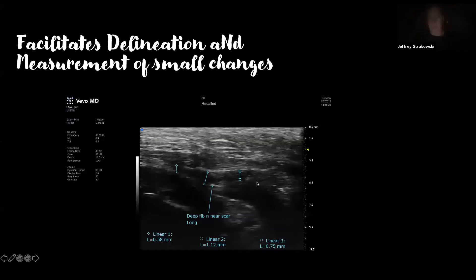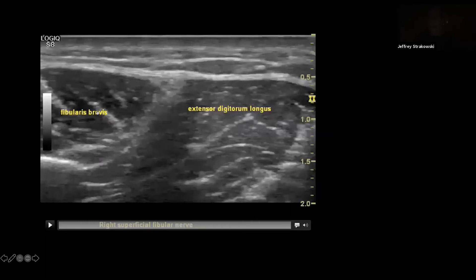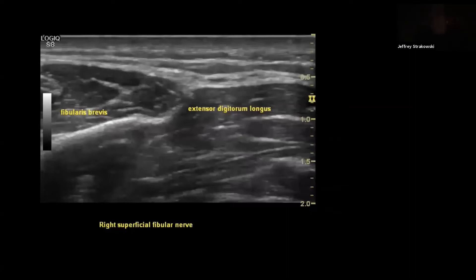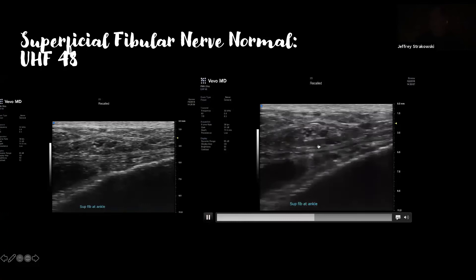For the superficial fibular nerve — by conventional ultrasound, we can find those fascicles. In most people it exits the lateral compartment about 8 to 12 centimeters proximal to the tip of the lateral malleolus, with some individual variation. The more distally it exits, the more likely it is to get injured with an inversion sprain injury. We can see it between the extensor digitorum longus and fibularis brevis in longitudinal view, then see it exit the lateral compartment and bifurcate into the medial and intermediate dorsal cutaneous nerves. The intermediate dorsal cutaneous innervates more of the lateral dorsal foot; the medial dorsal cutaneous innervates more of the medial dorsal foot.